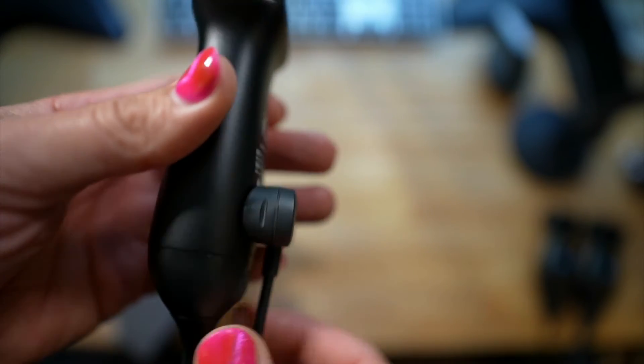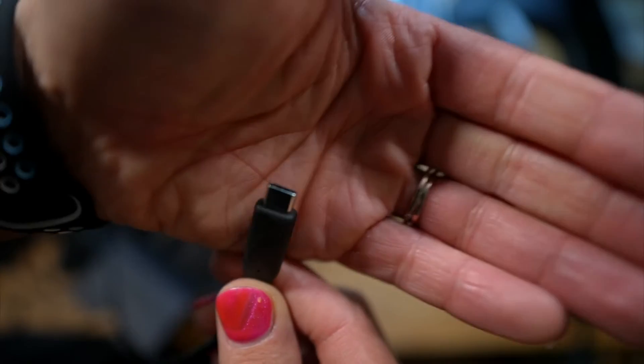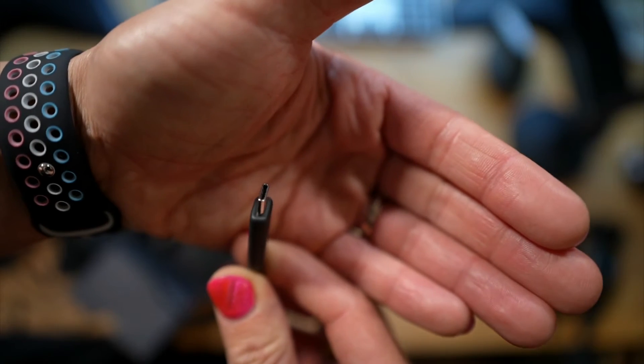It's actually quite nifty how small the form factor is — this makes it so much more portable. And please tell me it's USB-C. And it is — we have USB-C, which we're very excited about.